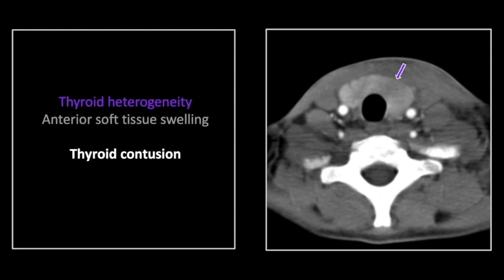There is diffuse enlargement of the entire thyroid gland, and there is an ill-defined region of hypodensity involving the left thyroid lobe and a portion of the isthmus. There is also significant anterior soft tissue swelling.